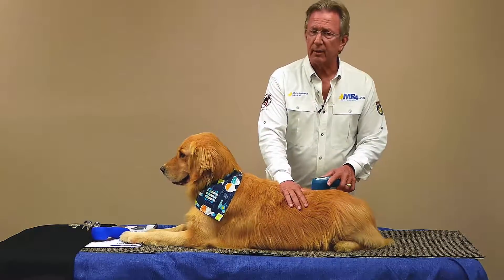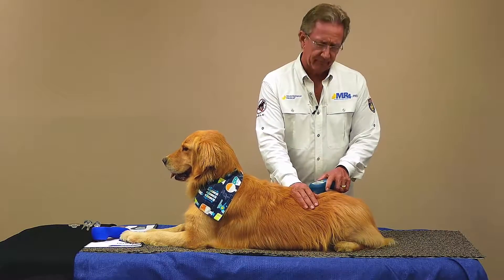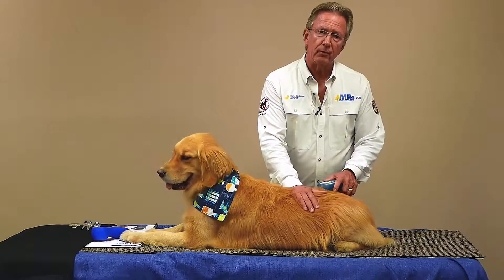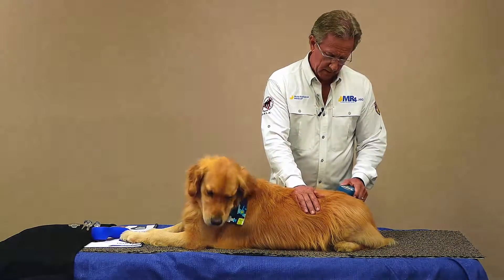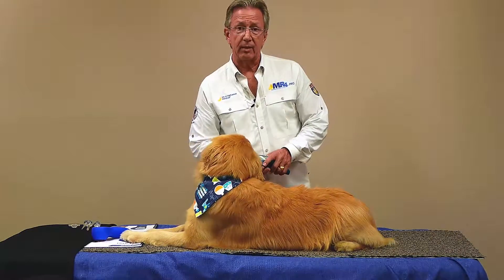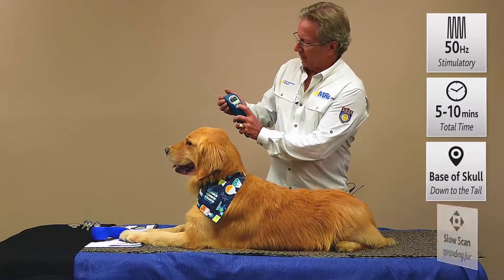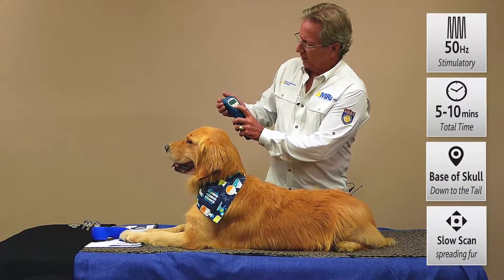That's the unwind protocol — this is a great place to start. It helps get the animal acclimated to the feeling of laser and it's really good for relieving pain. The other kind of unwind protocol would be with 50 Hertz to stimulate blood flow, which in these older dogs is sometimes really nice. We just step it back, come back to 50 Hertz, and press select.